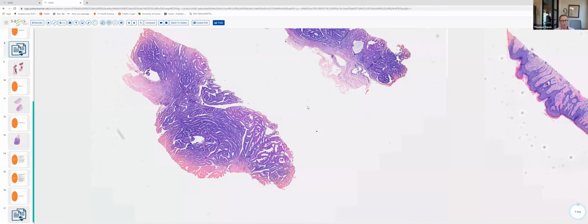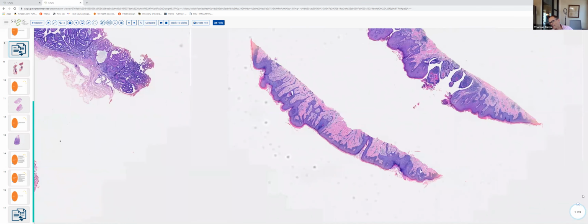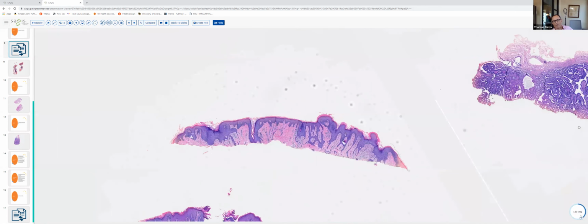This, of course, is a tumor that tends to occur in apocrine-rich areas, commonly on the vulva. Occasionally, you'll see them on the breast or on the eyelid or in the ear canal, and these tend to be deep. Now, one of the key differentials is another type of glandular tumor, and we'll take a look as soon as I tilt this, a syringocystadenoma papilliferum.